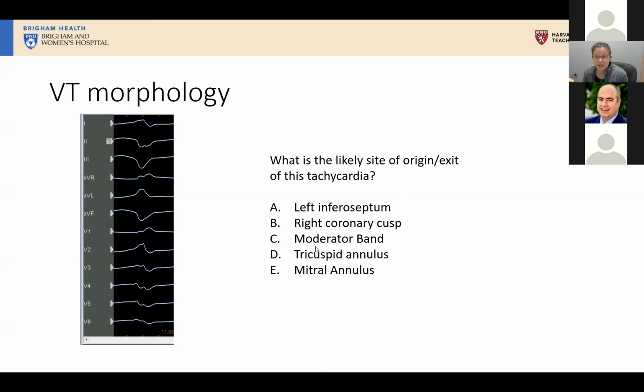Yes, I should have mentioned that. I don't personally have experience with that, but Dr. Valderbano's group has done it a lot. I think the things to be worried about, both with arterial and venous alcohol, is to be worried about collaterals. One of the things that our interventionalist does for the arterial alcohol administration is you really want to make sure that when the balloon is occluded and you inject contrast, you don't see collaterals to other circulations, because I think one of the worst things you can do with this type of ablation is get uncontrolled alcohol in some other distribution and reduce their EF further, especially for some of these sick cardiomyopathy patients.